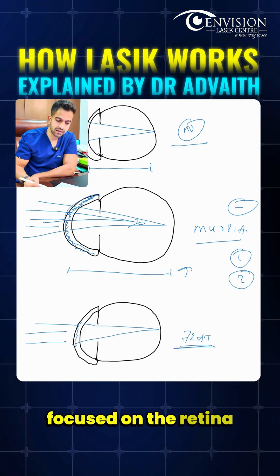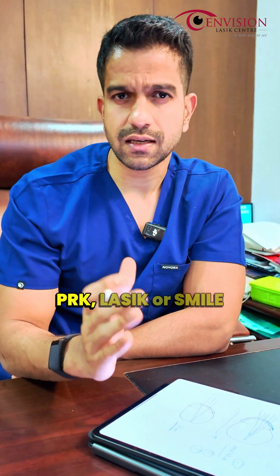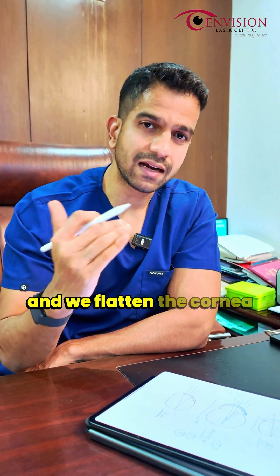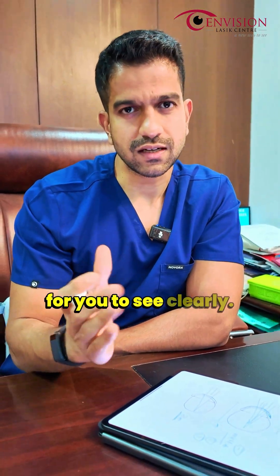Any laser vision correction — PRK, LASIK, or SMILE — follows the same principle: we reshape and flatten the cornea so that light rays are focused on the retina for you to see clearly.